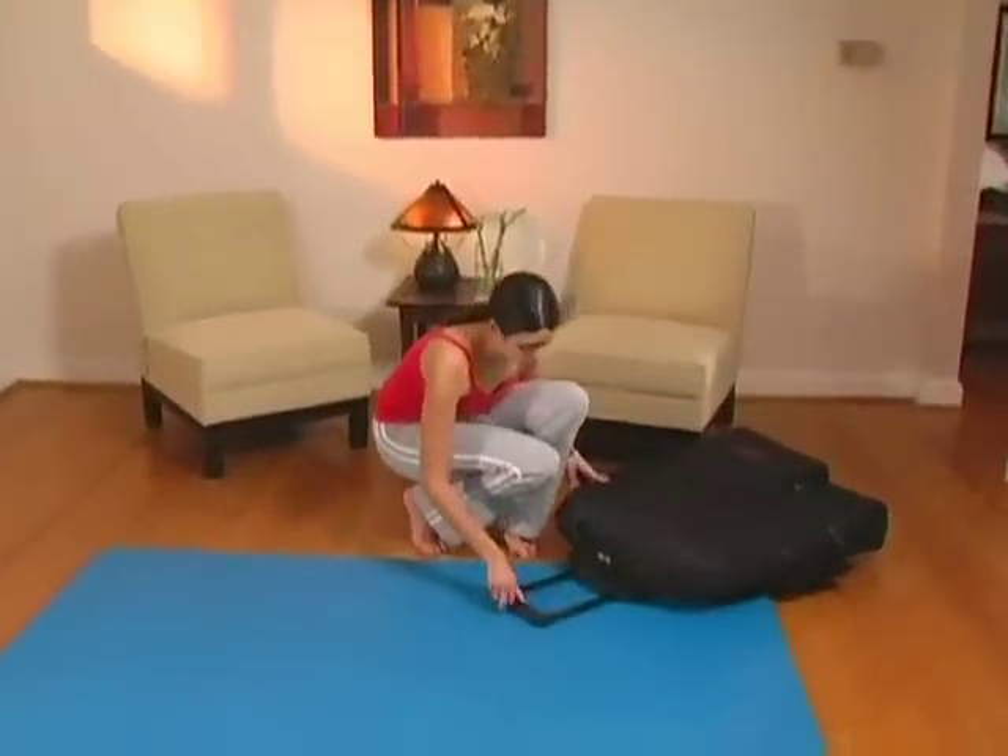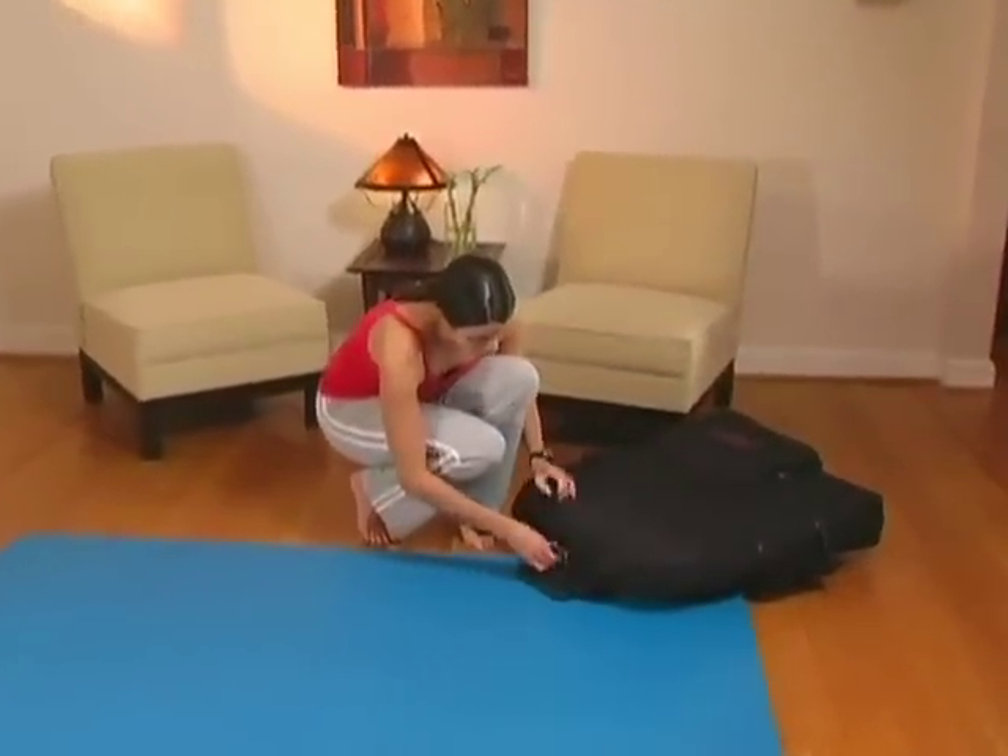Congratulations on selecting ComfortTrack, the most advanced home lumbar traction system available.